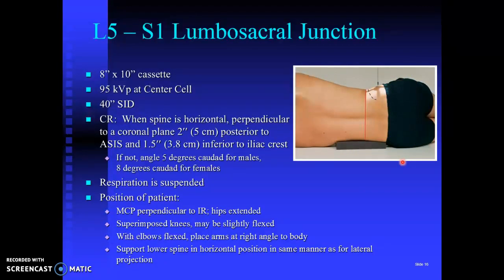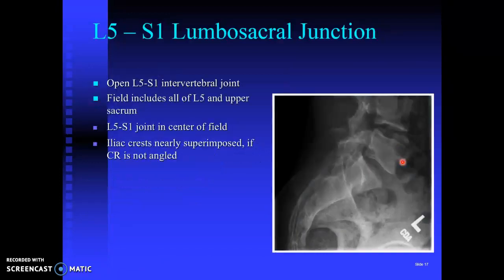And ensure that the arms are up out of the way as well. On your radiograph, you'll be able to identify the interspace of L5-S1. You may also see most of L4 as well as most of the sacrum in the center of your image.